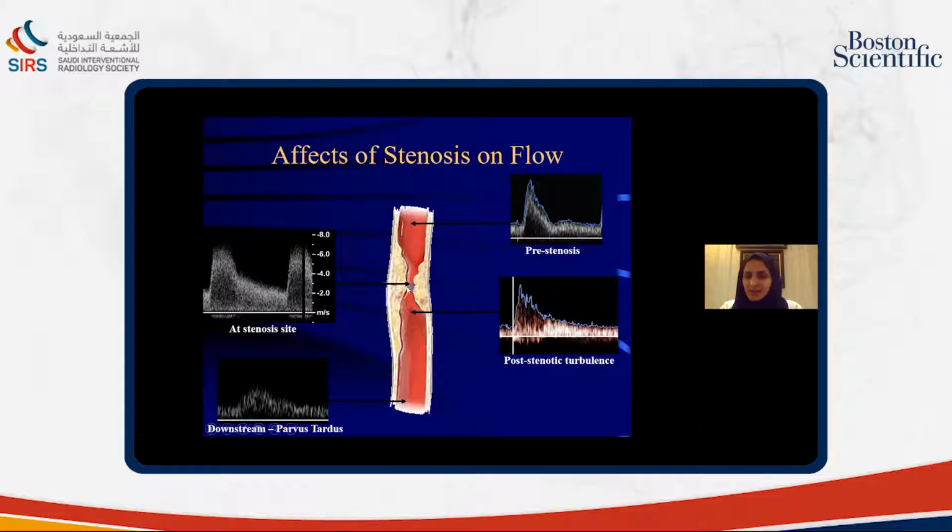We have a vessel with stenosis. Pre the area of the stenosis, we will not have a normal waveform. Still, we will have what we call pre-stenotic flow. I usually call it in my notes a stressed waveform. There is nothing proximal, but the problem is lower to that area, so we call it stress.